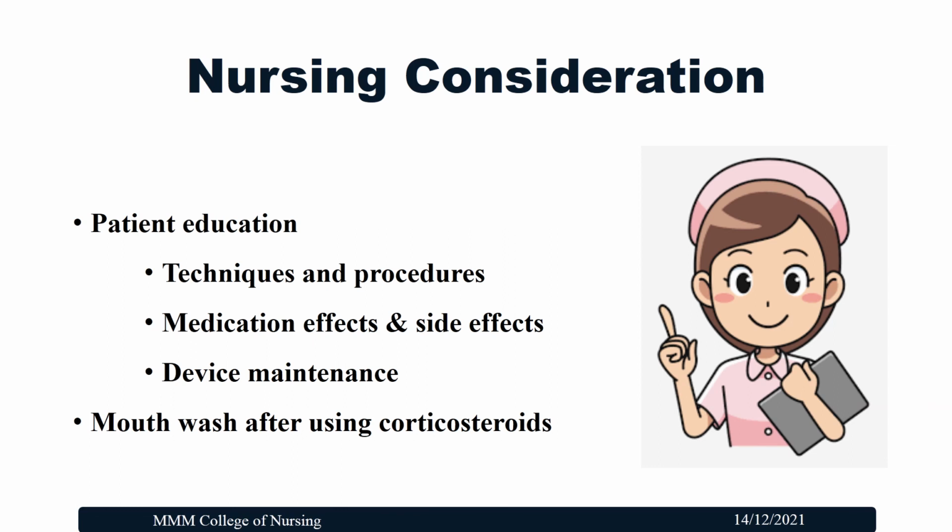As metered dose inhalers are based on self administration, it is highly needed to educate the patients regarding the techniques and the effective usage of the metered dose inhaler. We need to explain to the patient the medication action and side effects, and also how to maintain the device, like cleaning the mouthpiece, which is highly important to prevent infection. When the patient is using corticosteroids, it is highly needed to take a mouthwash following the medication administration.